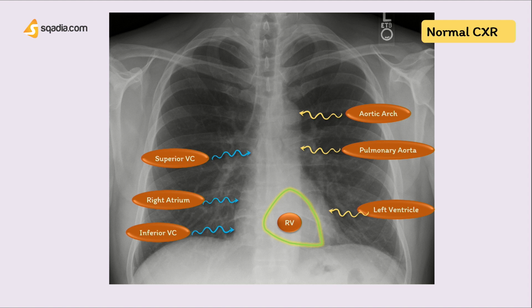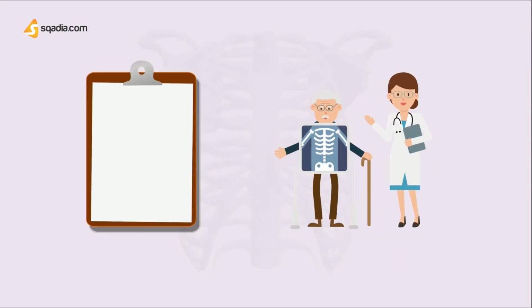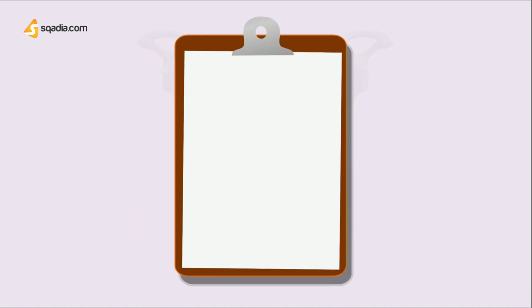Now, coming to the presentation of a chest X-ray. In order to present a chest X-ray, you should always try to do it in a systematic way to ensure you cover all areas and do not miss anything important. This is how it should be presented.